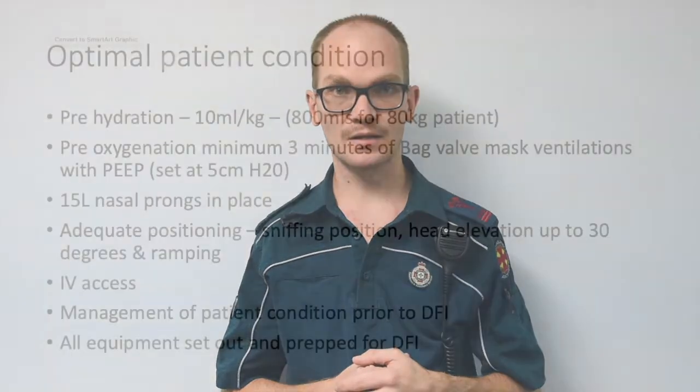This is the third video for PAR5430, the drug facilitated intubation procedure. So, we're going to cover a few topics. Intubation plans, that includes our crew briefing, how to perform direct laryngoscopy. We're also going to do ETT placement, how to confirm when we've got a tube in place, and also the post-procedure cares. So, let's get into it.